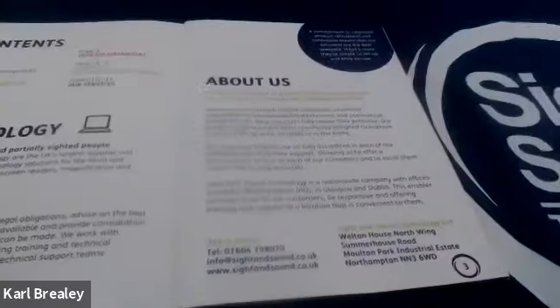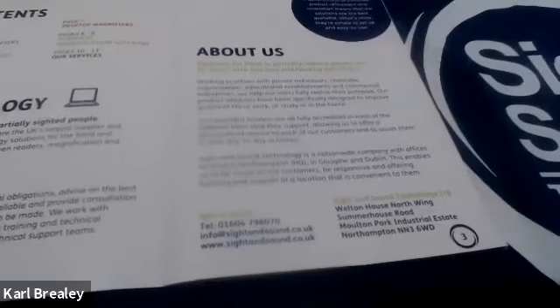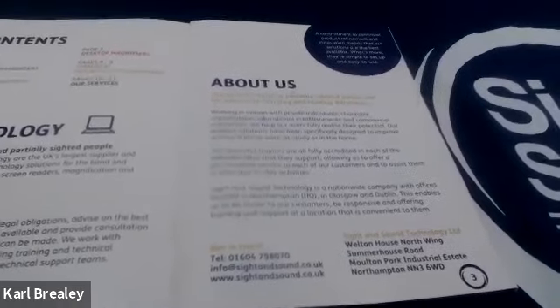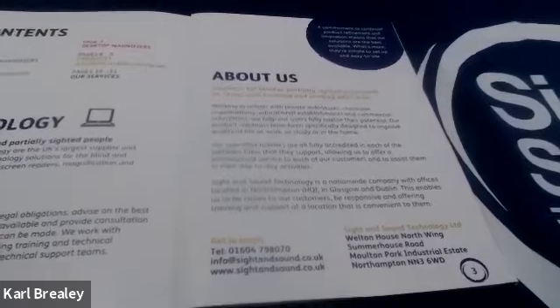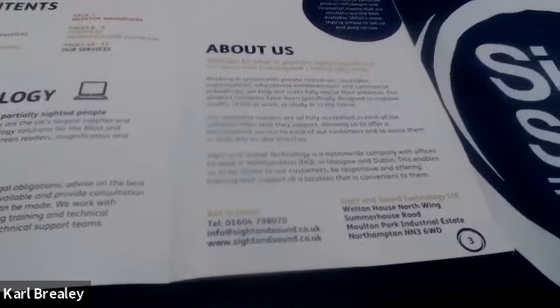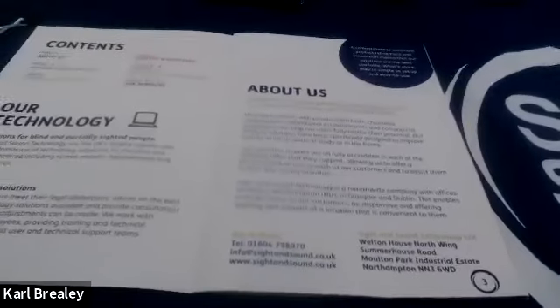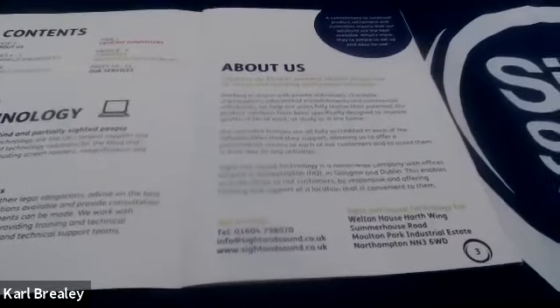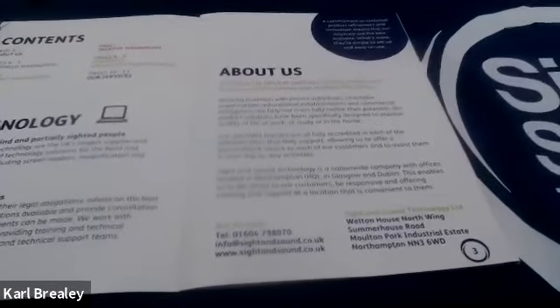So thank you. David asks, is there any noise or assistance to help you find it if it falls? No, that's why we have the lanyard. It's completely and utterly recommended to make sure that lanyard is connected. Because then you've also got something that's about 18 inches hanging off the back of it, so if you do drop it, you're able to find it.